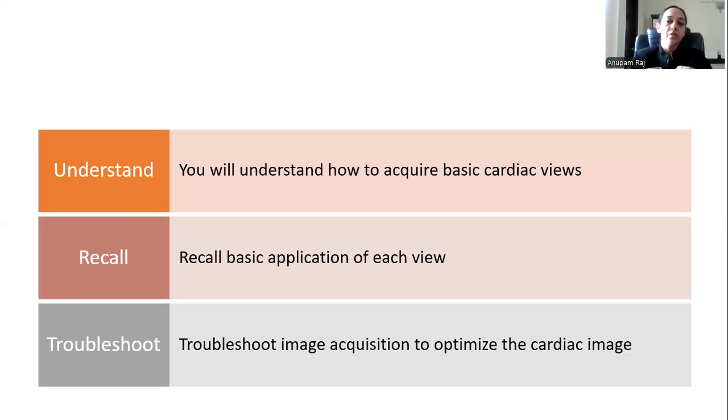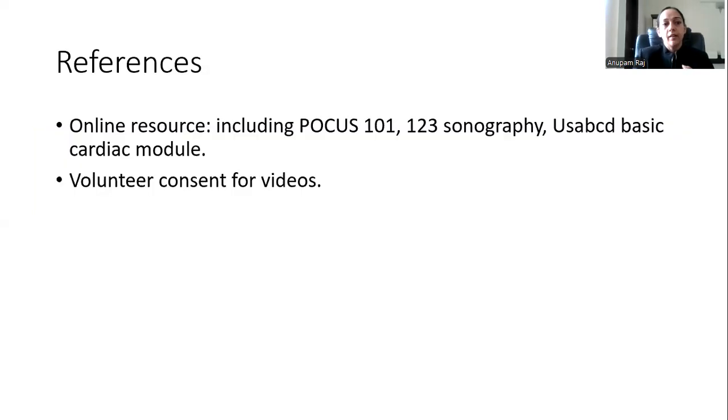I would suggest that you pick one view at a time, go stepwise, and try to achieve that best view. And once you have learned one view, go to the next view, and then you can learn further, one by one.